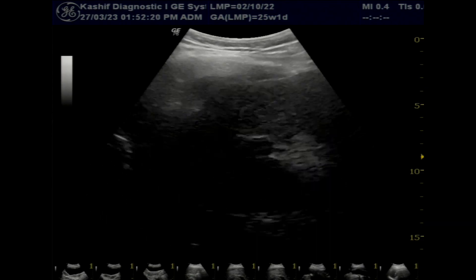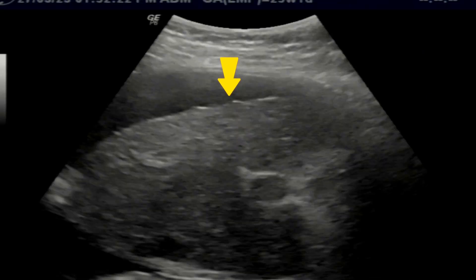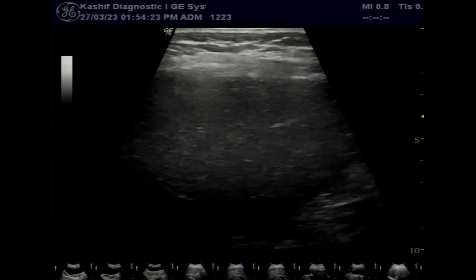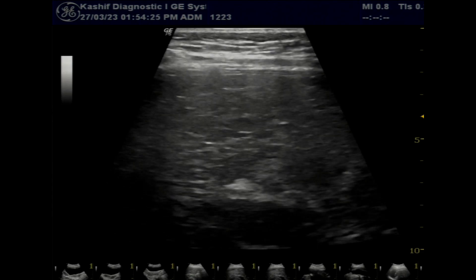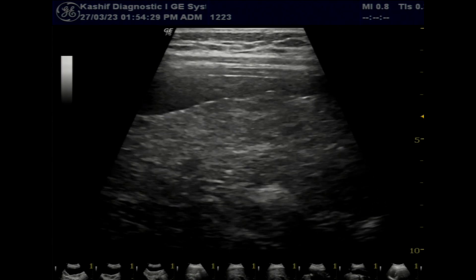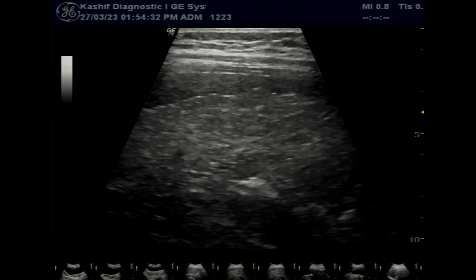The most important causes of liver cirrhosis include alcoholic liver disease and viral hepatitis, as in this case — hepatitis C viral infection. There is a small, slightly hypoechoic nodule of size 10.1 millimeters. A clearer view is obtained showing a mild bulge from the inferior surface.